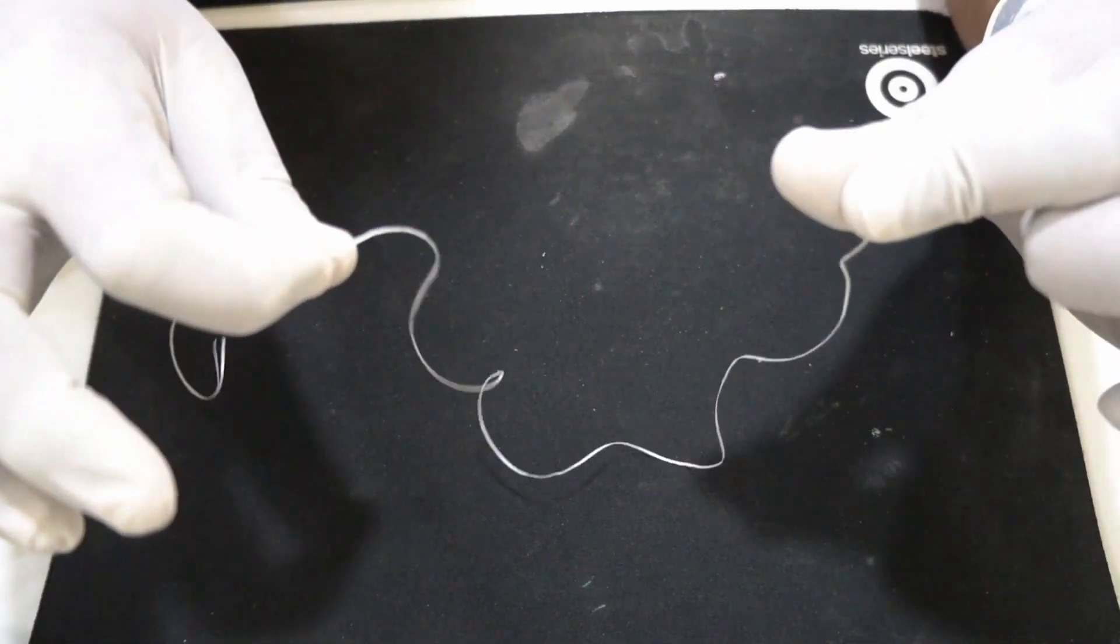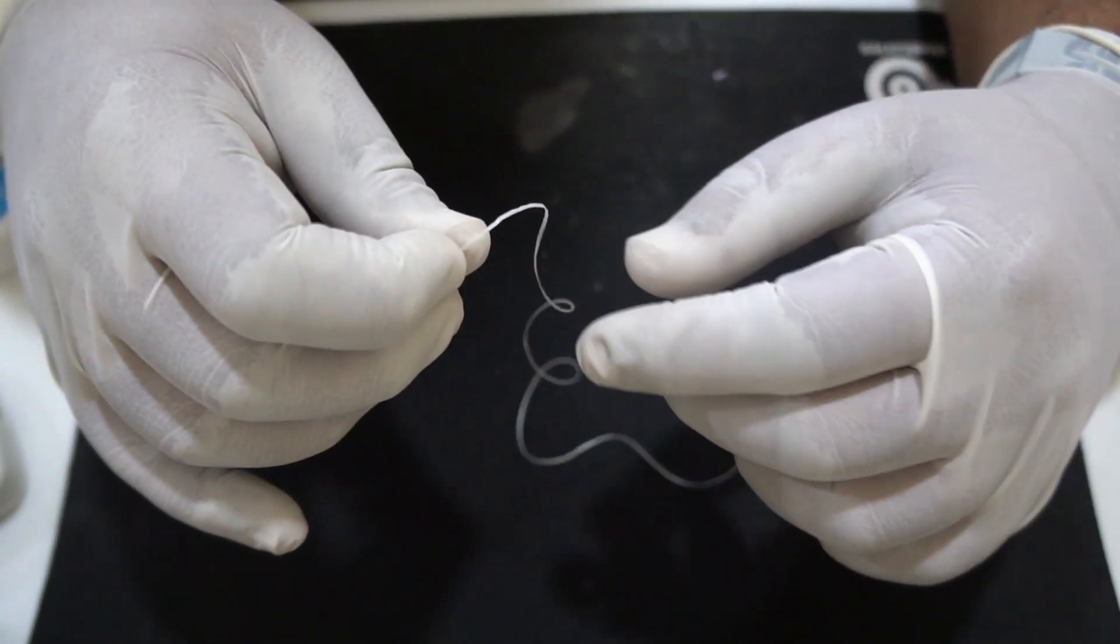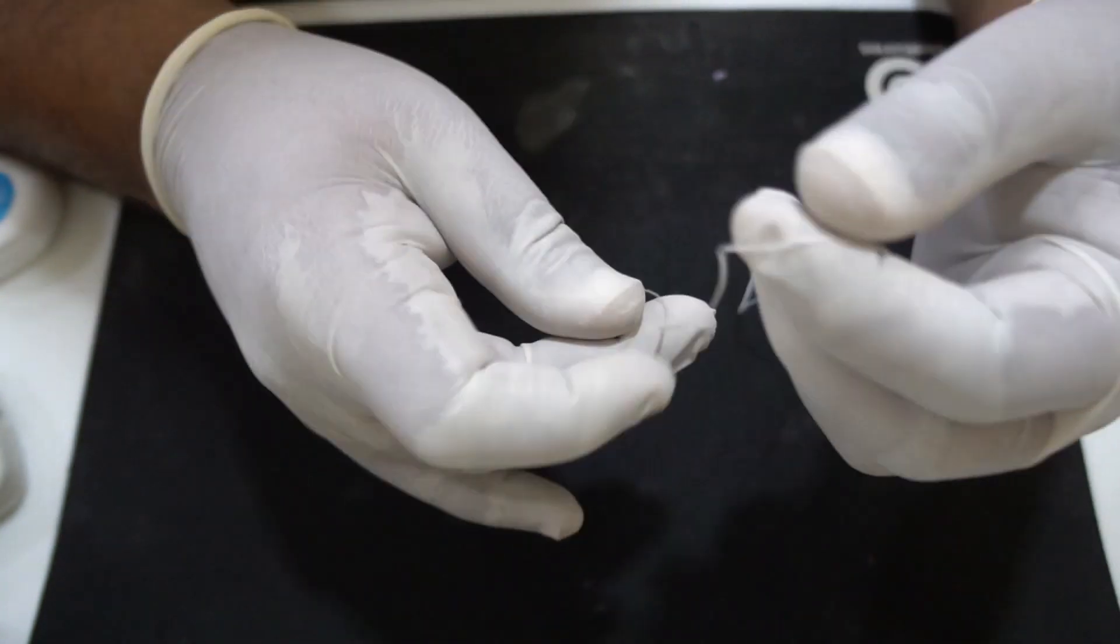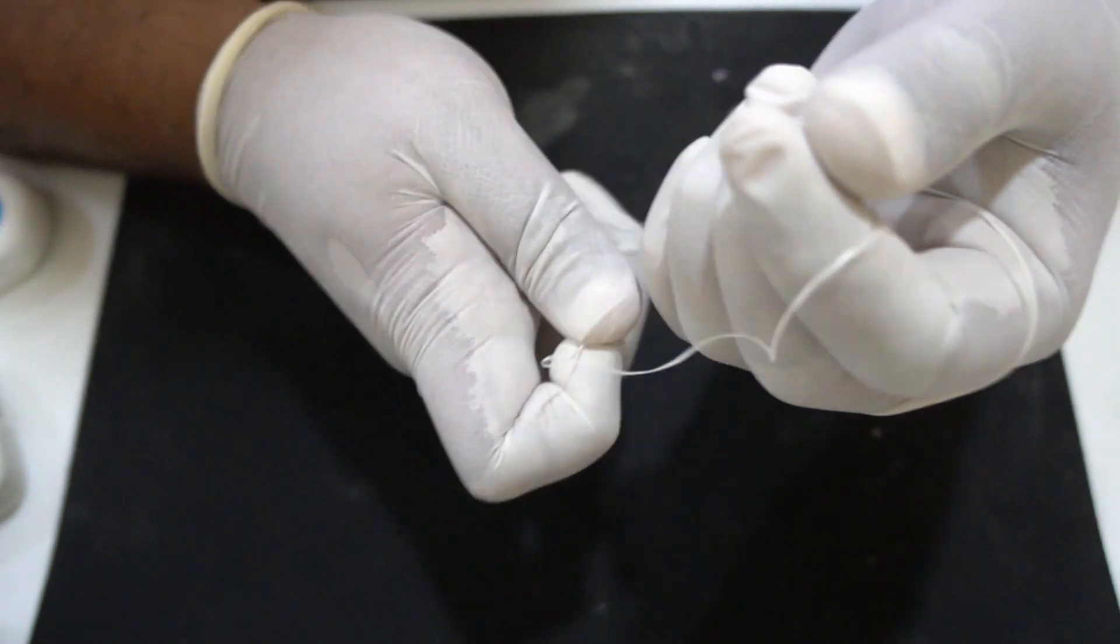So to make a floss ligature, take about a 15 to 20 cm stretch of floss. The brand of floss doesn't matter. Choose whichever one you are comfortable with. Stretch it between your right hand and left hand, like so.